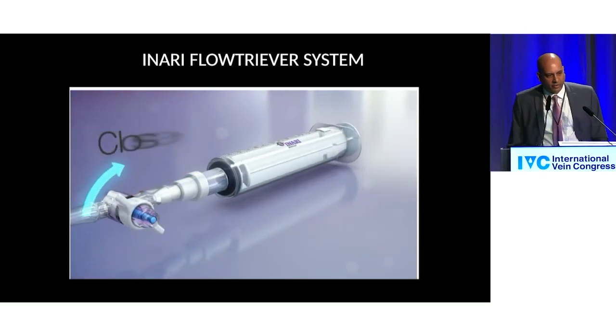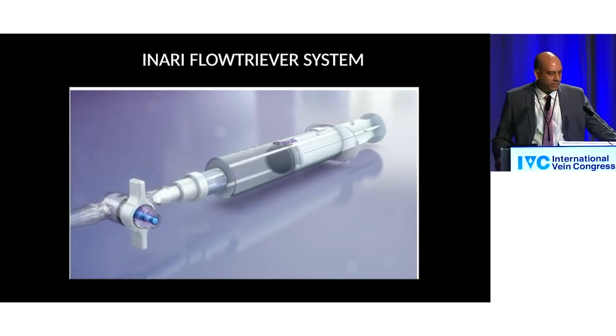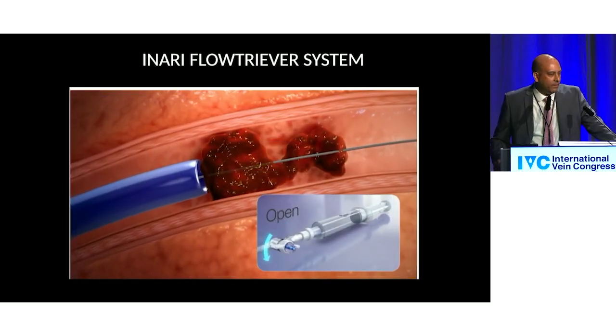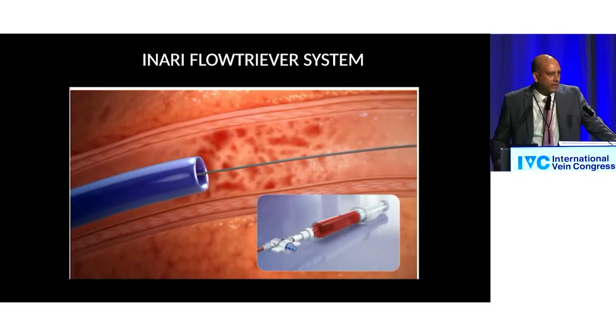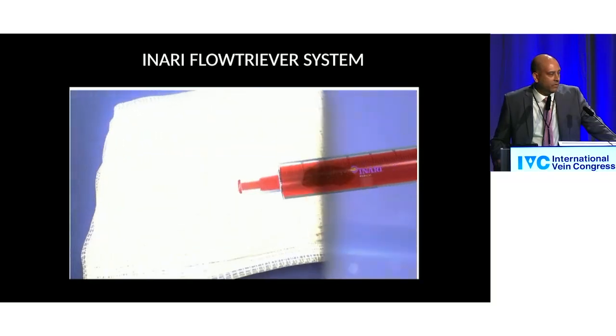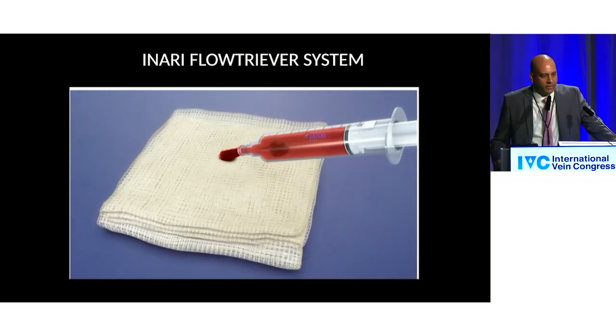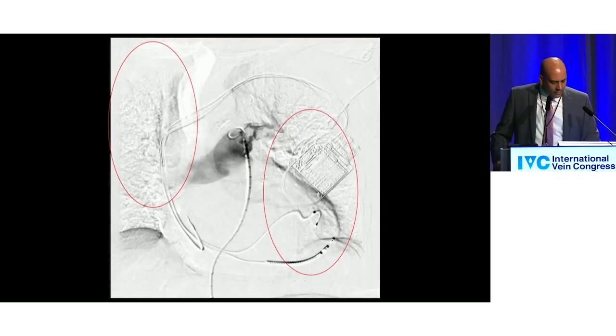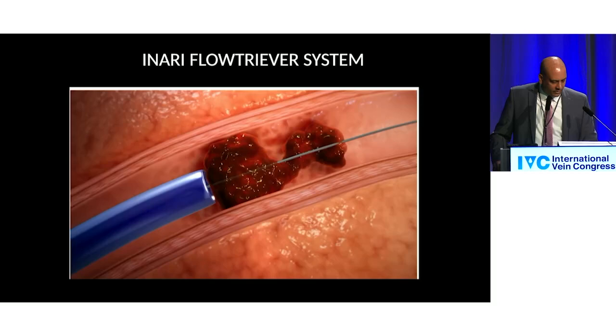And you can see that the suction embolectomy catheter works just like what you're used to. You have a little bit fancier syringe where you can lock it. You basically put the catheter up to where the clot is, or the PE, or DVT if you're using it for that, because they have a different system for that. And you're basically aspirating or sucking out this clot. And then if you look at this here, sorry about that, I'm going to let this play again, guys.